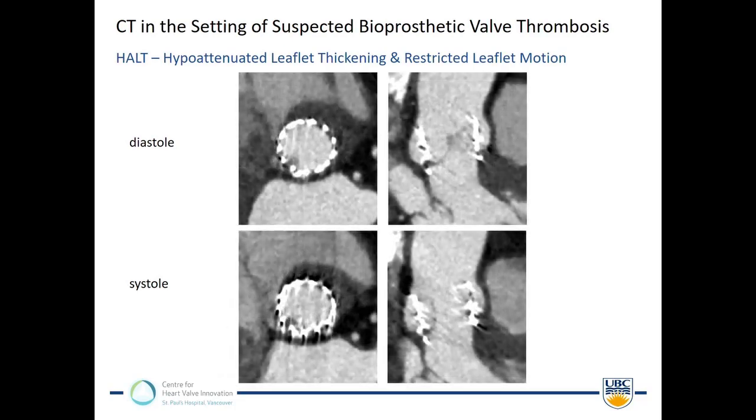Different patient, a less pronounced finding. Upper image, again, diastole. You see that there is, on the base of one leaflet, a little bit of meniscal thickening. And again, this is in keeping with leaflet thrombosis. And in systole, very similar finding. Again, the same finding here. And most importantly, if you have good image quality, you can actually see that the leaflet starts hinging at the end of the thickening. So even a little bit of thickening will cause leaflet restriction.